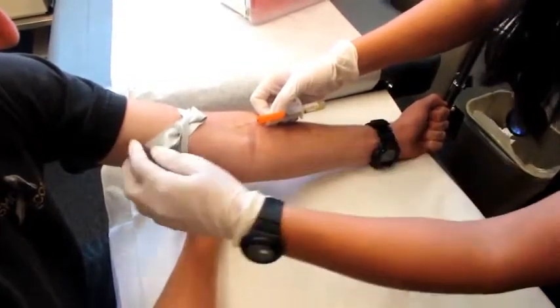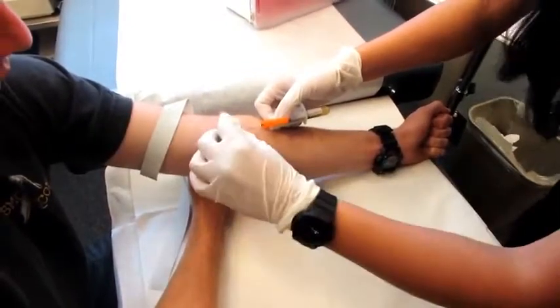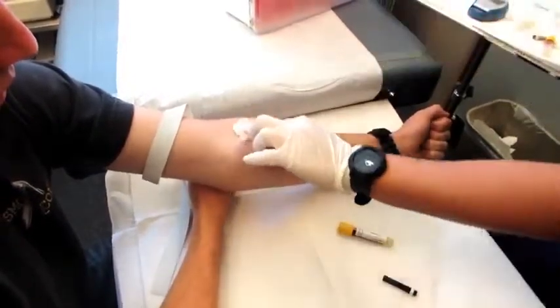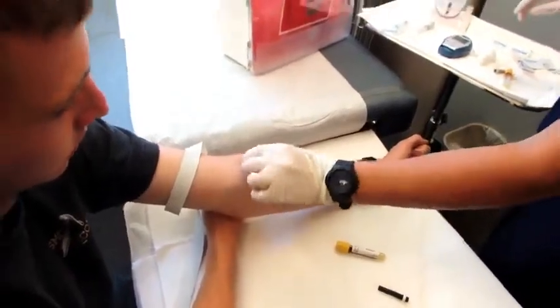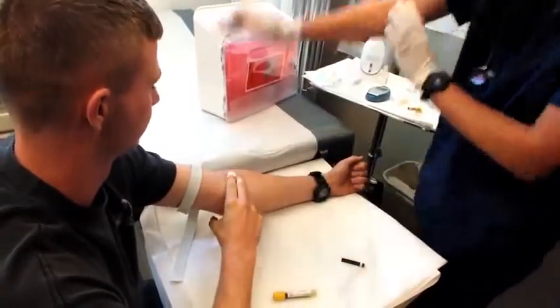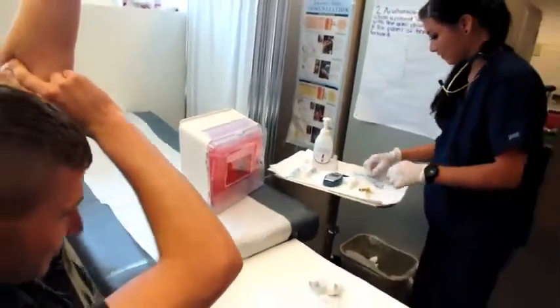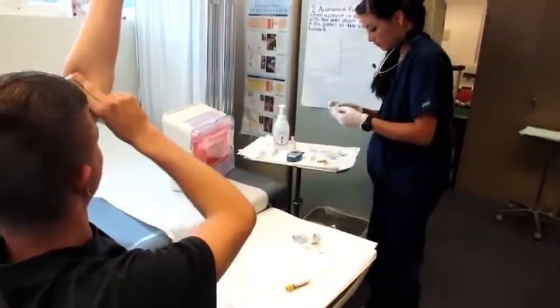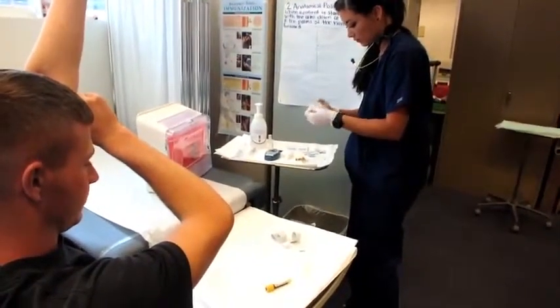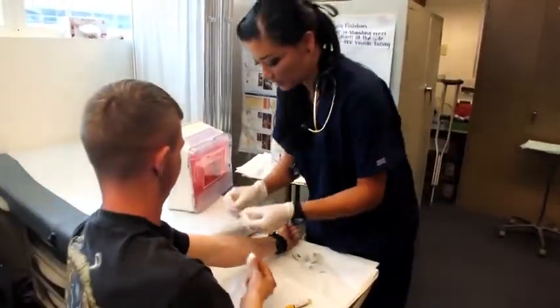Okay. Release the tourniquet. Move the tube. Good job, Tanaka. Okay. Now you got your blood. Now put your fingers on this for me. And hold it above your head. Okay. Gonna be good.